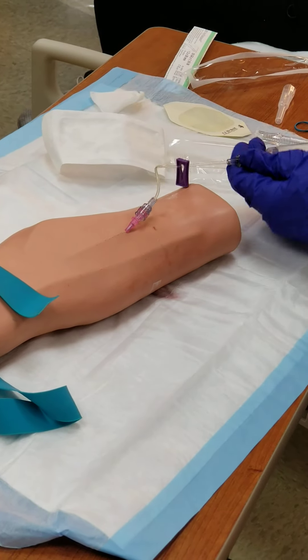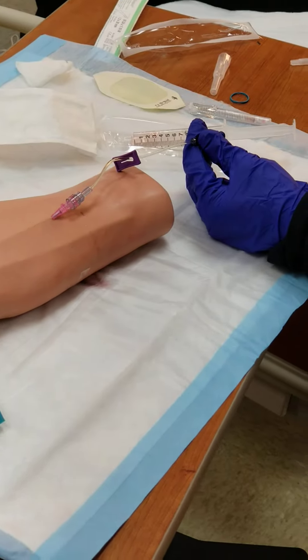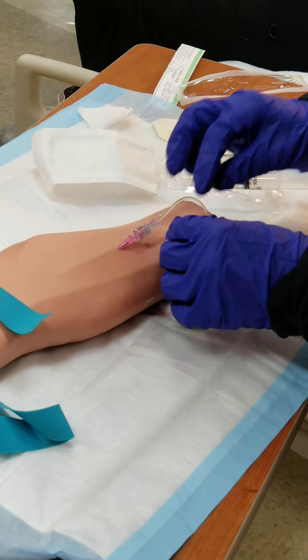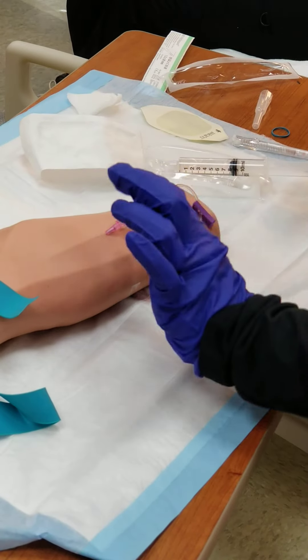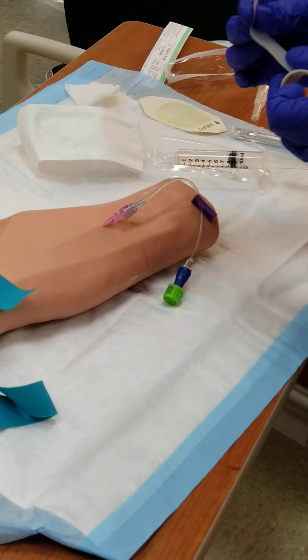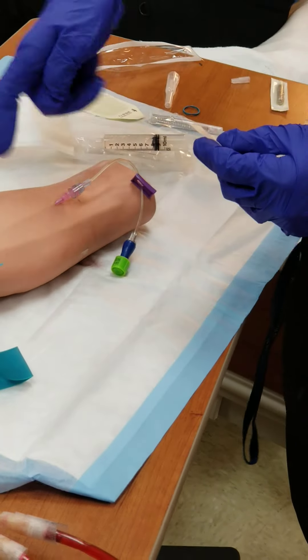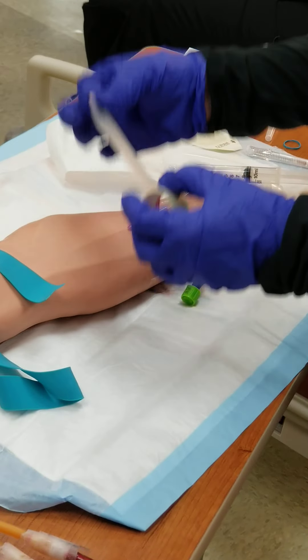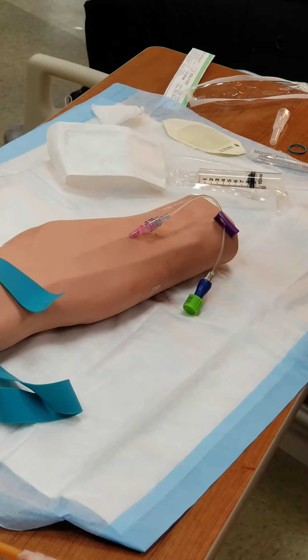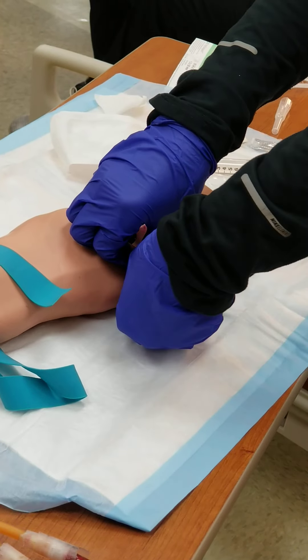And then in that top drawer to the far right, there should be some Curos caps. This has a little chlorhexidine sponge in there, typically. And I like to use the little stat lock. You can put tape like this, but just make sure you're not touching this right here because it's going directly over that. You want to stabilize that thing somehow — it will make its way out if you're not careful. Those stat locks are awesome.